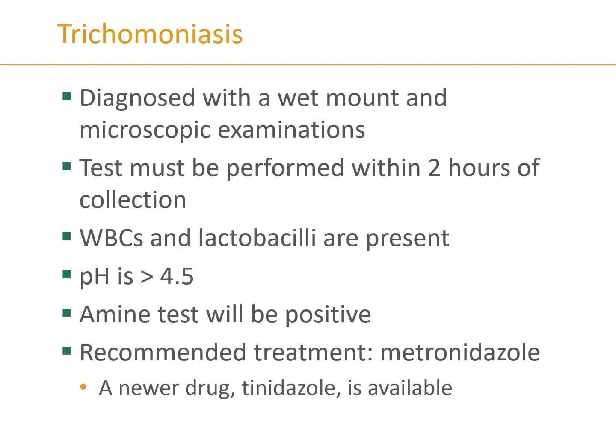It would be diagnosed using a wet mount. You're looking for that jerky motility. The test should be performed within 2 hours of collection. It could also present with white blood cells and lactobacillus in that wet mount with the Trichomonas, with a pH greater than 4.5 and a positive whiff test. And of course you could treat it with antibiotics, and there are some new treatment methods out there too.